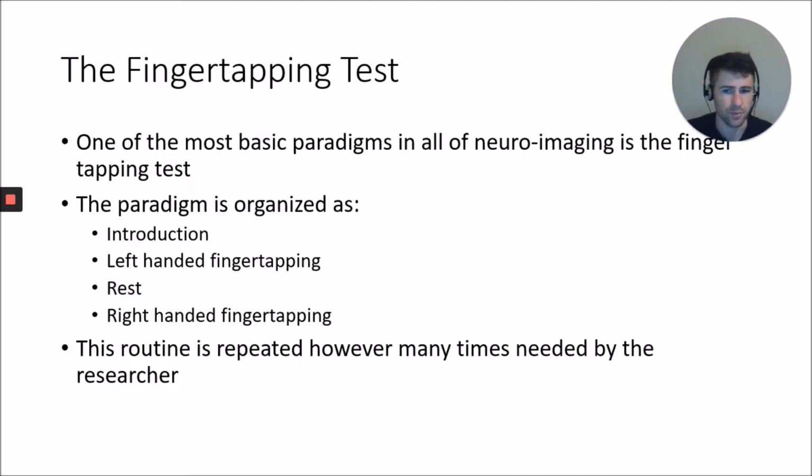Each of these will be repeated a number of times determined by the researcher. For our sake today, each condition will have 3 trials just to get a little average, but you could do 5, 10, 15, however many trials you need for your experiment.